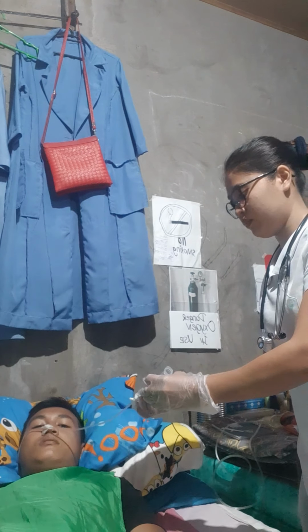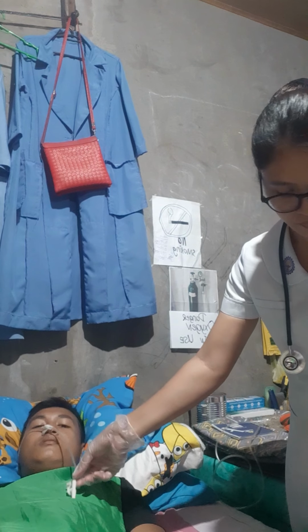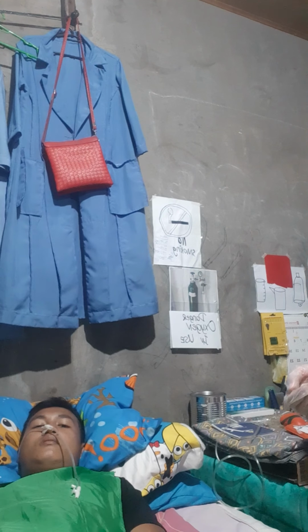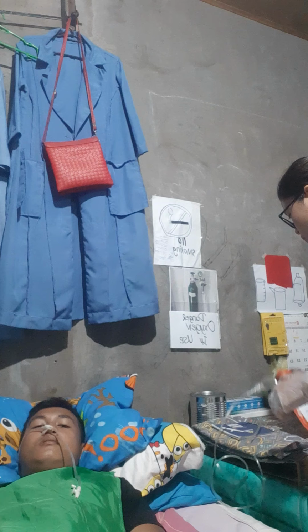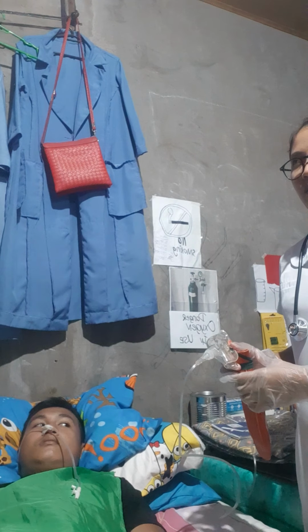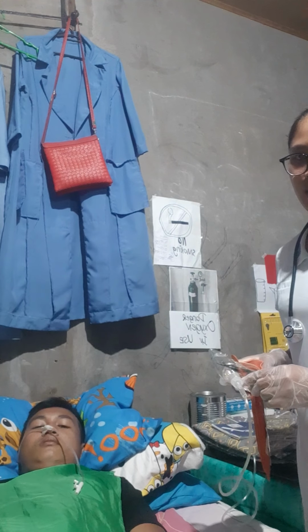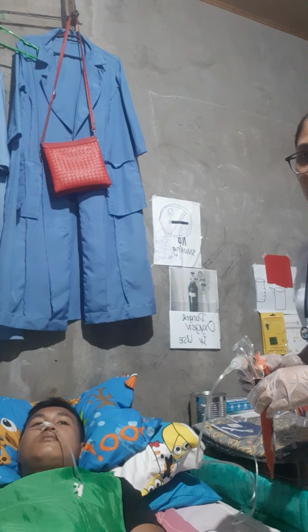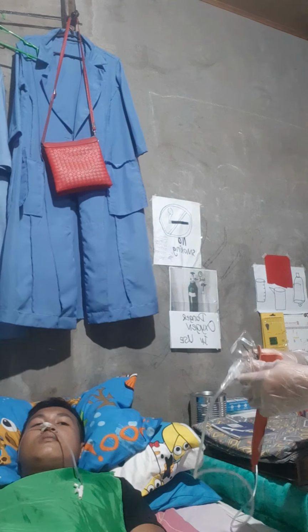So we need to hang the labeled bag from an infusion pole about 30 centimeters, or 12 inches, above the tube's point of insertion for the client. Then we need to clamp the tube and add the formula to the bag.